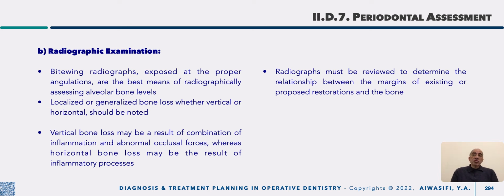This is one of the most important examinations for periodontal assessment, and you are not in need of extra views. Your bitewing, with proper exposure and proper angulation, is the best diagnostic tool for assessing the periodontal tissues, especially the alveolar bone level.